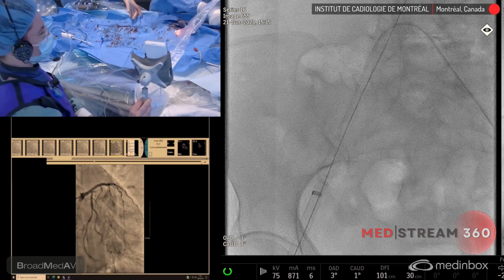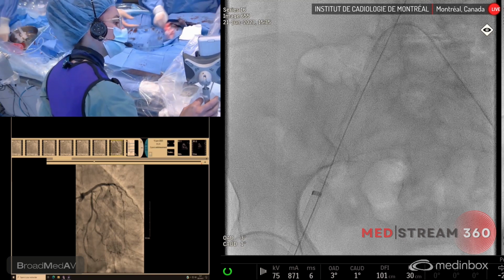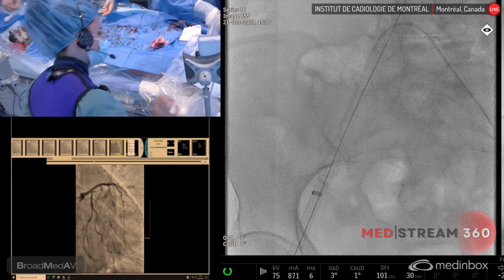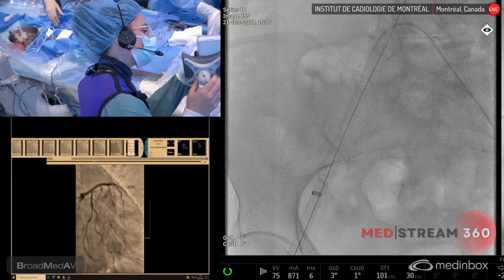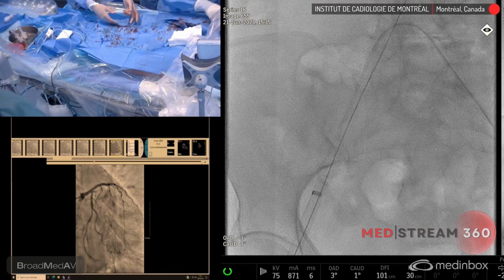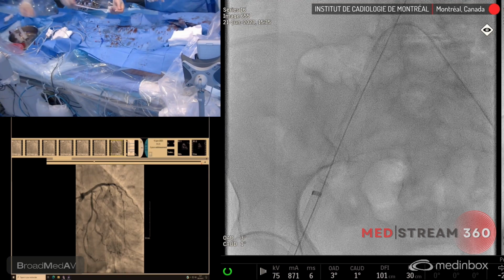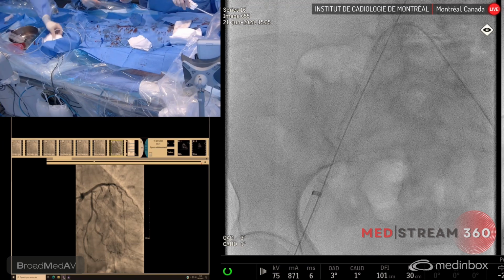Okay, while it's going to do the ultrasound, while I just take out the dilator, prends les compresses sèches, s'il te plaît. Merci. A little challenging to see. Donc on a dit 5, c'est ça? Okay. This one's a little bit harder to see. She has a small hematoma there from her right heart cath. Prends les compresses mouillées, s'il te plaît. Je vois quand même bien.